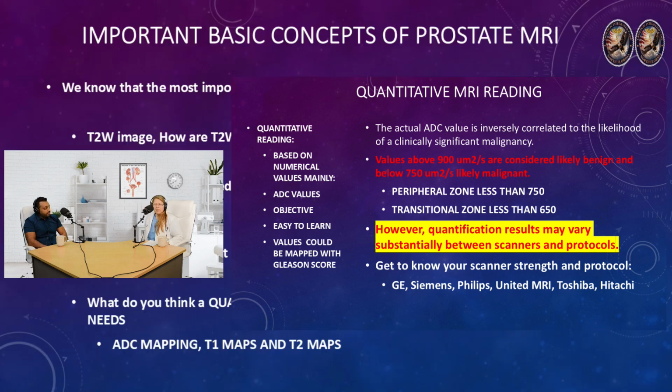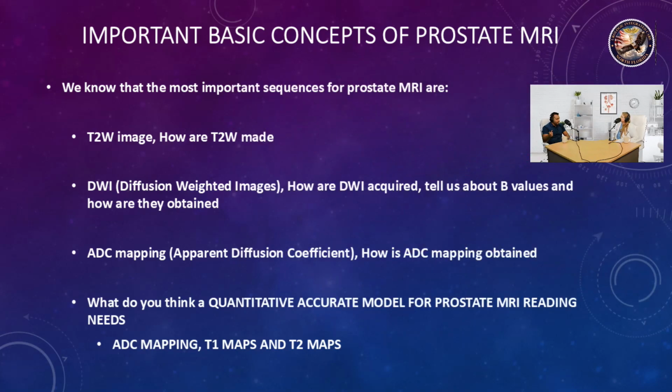Next slide. Well, that's a really good point, actually, that for active surveillance, qualitatively you can say, oh, the tumor looks a little worse, but if you have numbers, it might make it easier for the urologist to say, maybe it's time to actually intervene now. We've been surveilling it for a little bit, I see these numbers going down, I see the PSA rising. It might give you just another metric that you can use over time, not just for a single time point. There are some academic institutions that are actually employing that, and hopefully in the next few years or less, we'll have some sort of methodology for that.